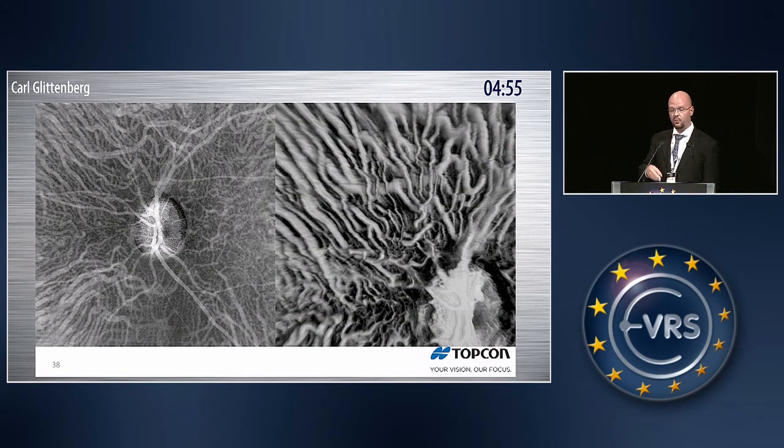Now the question is, what's the purpose of all this? If I can't show leakage in the choroid, why am I trying to visualize it in the first place? Now there are a lot of diseases, both systemic and local in ophthalmic diseases, that end up in either a thickening of the choroid or a thinning of the choroid. But up till now, we just define pachychoroid, or we define the thinning of the choroid, but we're not saying where it's thinning. We're not saying, is it thinning in the Sattler's layer? Is it thinning in the Haller's layer? Is it thinning or thickening because of the vessels thickening, or is it thickening because of the stroma thickening? So just measuring the choroidal thickness isn't going to work.